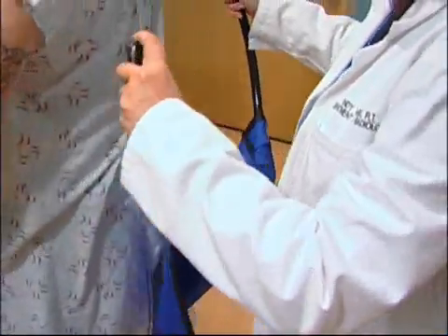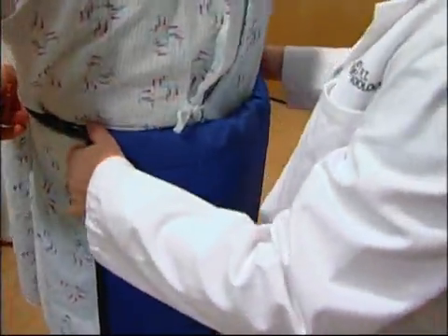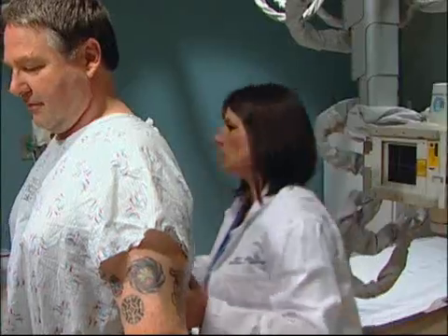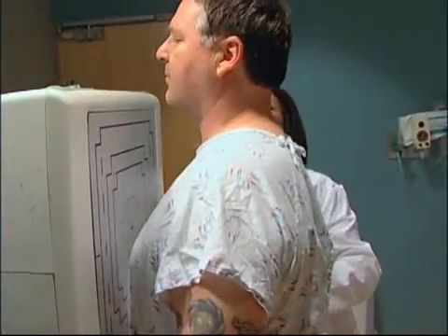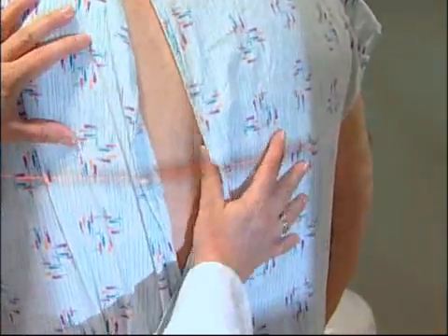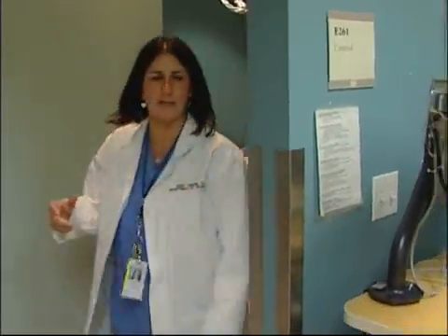This goes on around your back, right at the waist. Digital Radiography is painless. The x-ray technologist will make sure you're in a comfortable position for the exam. Roll your shoulders forward with your elbows out. I'm going to peek at your back just to make sure that we're centered here. Very good. Hold that position for me just like that.